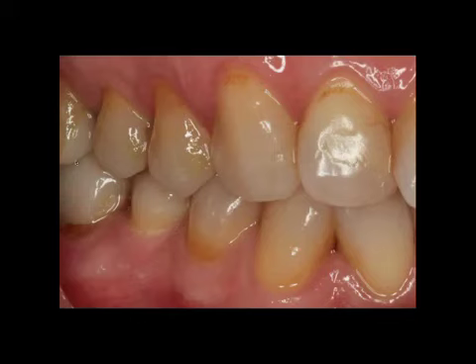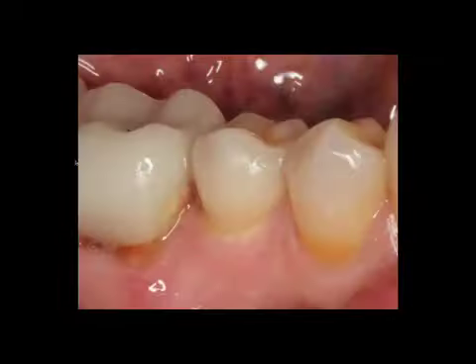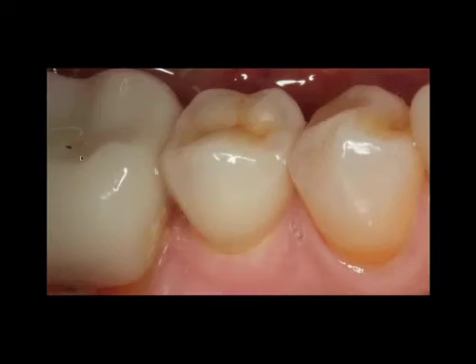Yes, we have connective tissue grafts. Yes, we have alloderm. But I would want a system that gives me the ability of avoiding these issues long term. And this is our beautiful result with a beautiful soft tissue.